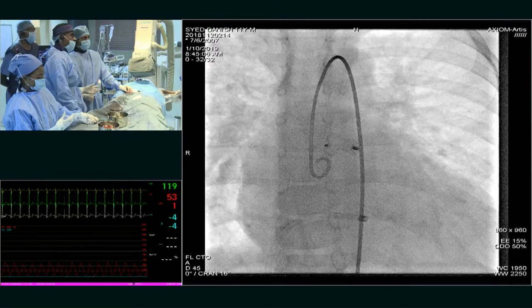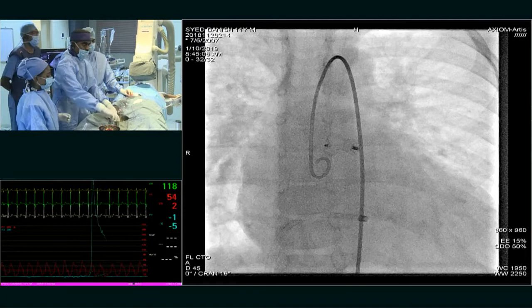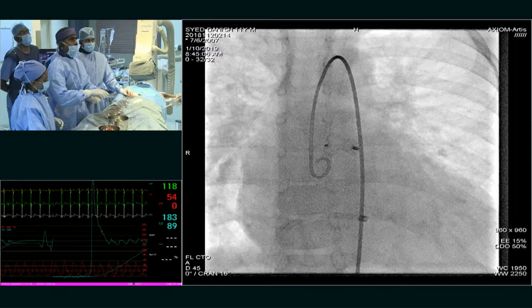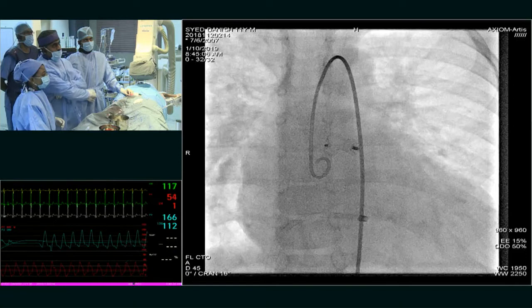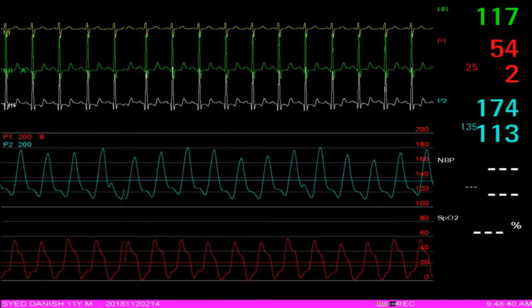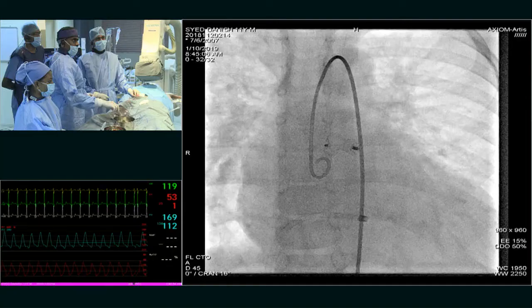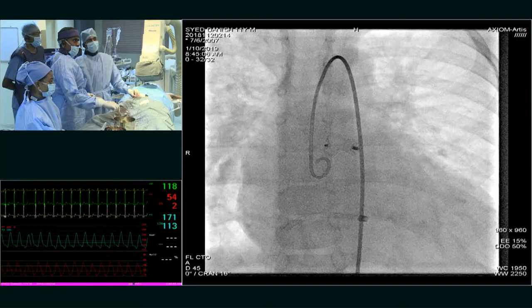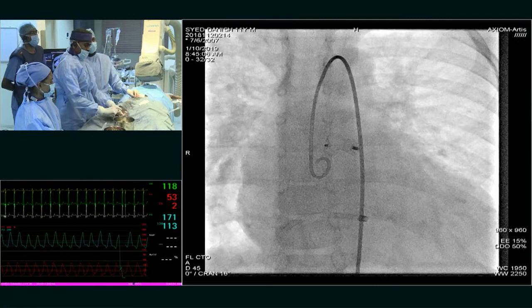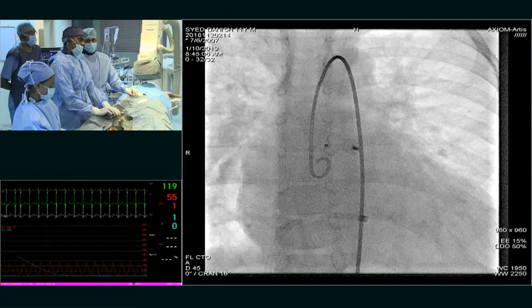Yeah. And the aorta might have gone up, I think. Just we are waiting for the injector to be loaded. In the meantime, I'll just show you once the aortic pressure live. So your choice will be a muscular VSD device. Yeah. So then you mean it is pulled more into the PA?